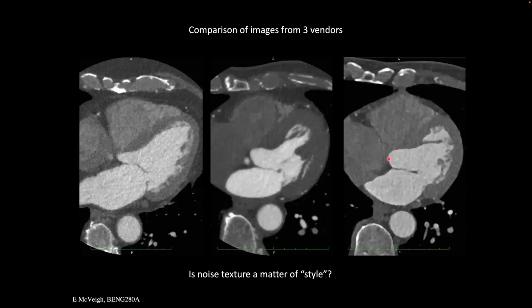This one, because it's got the best contrast. Okay. Boundaries are more defined as well. Boundaries are more defined. Yes, and this is exactly what you perceived, right? Look at this edge here, look at that edge here. It's so sharp. How did we make that happen? So that's true. This thing does have really sharp edges, and it has really constant values in the areas where it should be constant. So somehow the noise got reduced here compared to, say, this one, and the edges remained sharp.